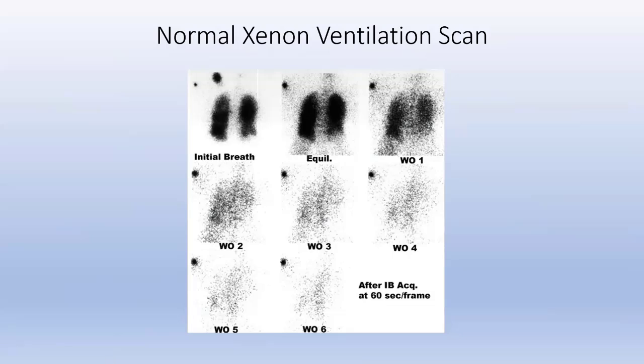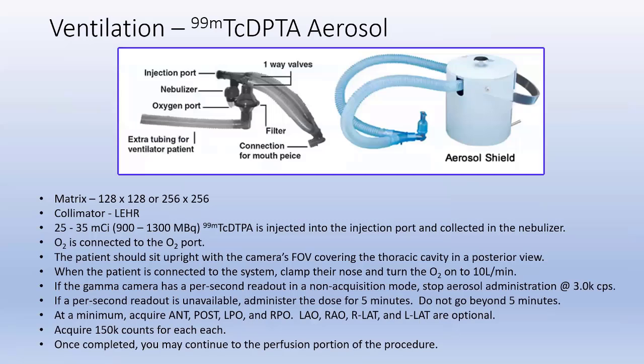Therefore, you really need to keep this patient on a little bit longer, again, until they exhale out the xenon. So now let's talk about DTPA aerosol, a slightly different animal.